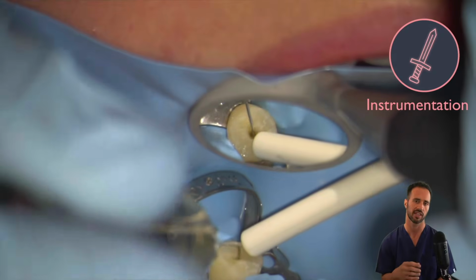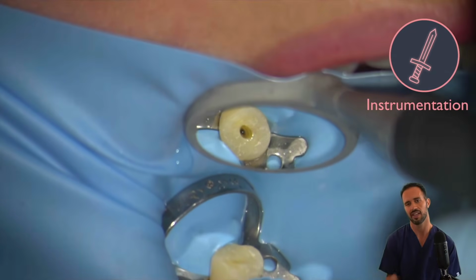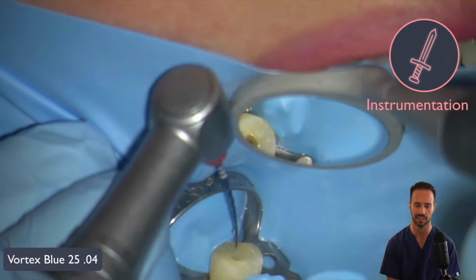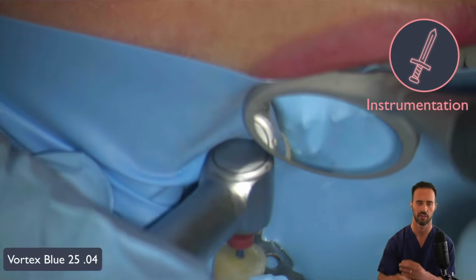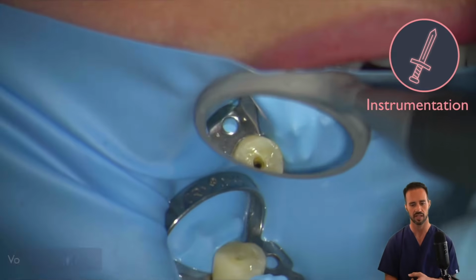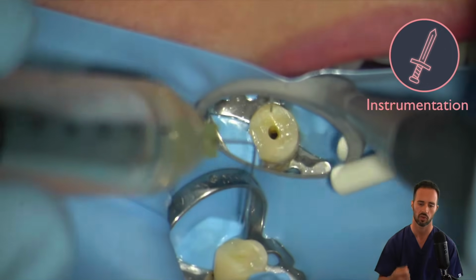When you're starting with the size 15 and working your way up, it's a very repetitive process, and that's nice. Your assistant appreciates that because he or she knows exactly how the procedure is going to go. And now we're with our size 25 Vortex Blue 04 rotary, and again, sodium hypochlorite in between.